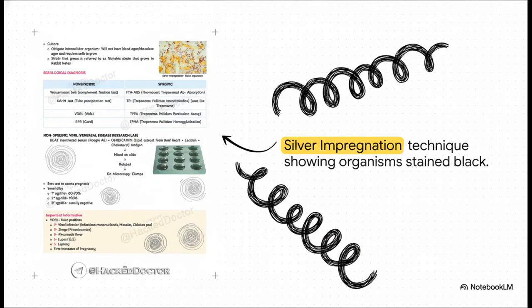But what if we're dealing with fixed, dead tissues rather than a fresh wet mount? Well, we use an alternative trick. Since the bacteria are just too thin for normal stains, like a Gram stain, we use a silver impregnation technique. Methods like the Fontana stain for fluid smears or the Levaditi stain for tissue sections literally deposit silver onto the surface of the bacteria. This physically thickens them up until they look like distinct black, coiled lines under the microscope.